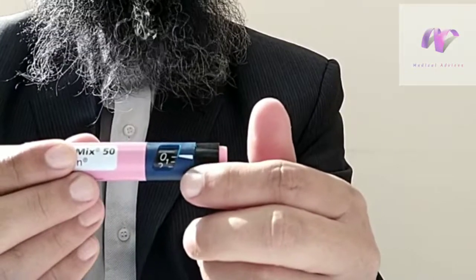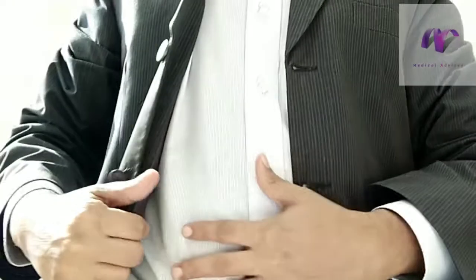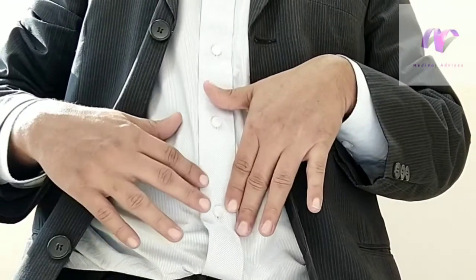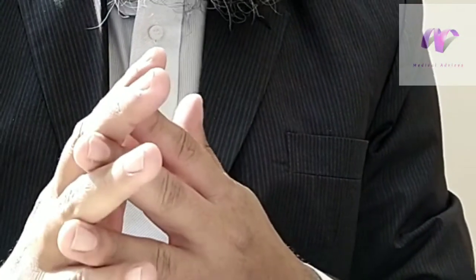First, you will do the loading. Here you load the required insulin unit, 2, 4, 8, whatever is required. After you load the insulin, you first need to inspect the site. The good sites are from the abdomen, and the abdomen you can divide into 4 parts, upper and lower, into the 4 quadrants maybe, and it should be 2 finger breadths away from the belly button, or you can move it on laterally where it's accessible. So these are the insulin sites. You also need to examine your insulin sites for lipodystrophies, so that when you are administering the insulin, you make sure that there are no lipodystrophies present on the insulin site.